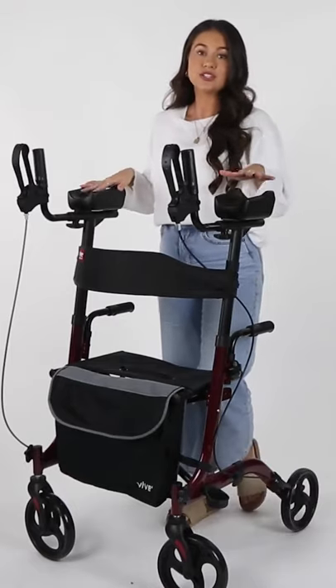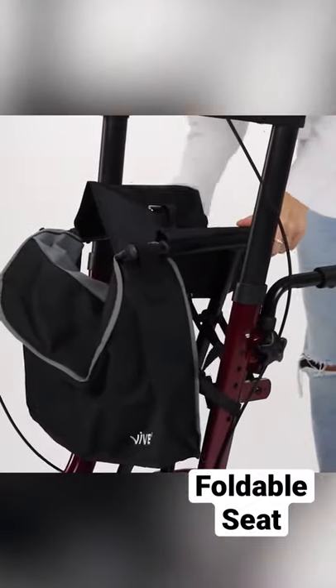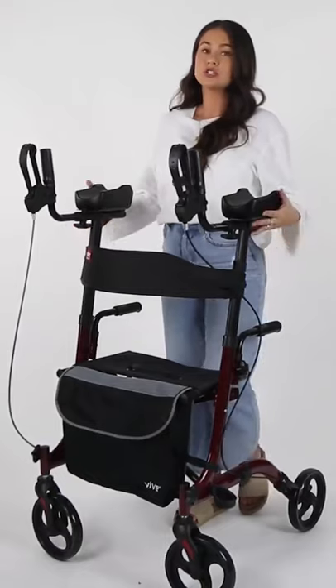It does feature a very compact foldable design here at the seat, so it can easily fit into the trunk of a car. It's also really easy to maneuver and it's made out of an extremely lightweight aluminum.